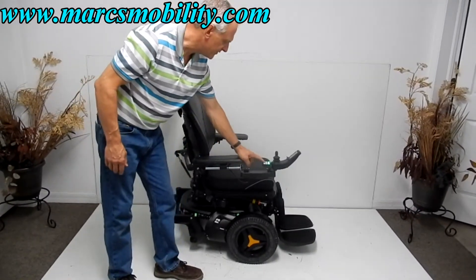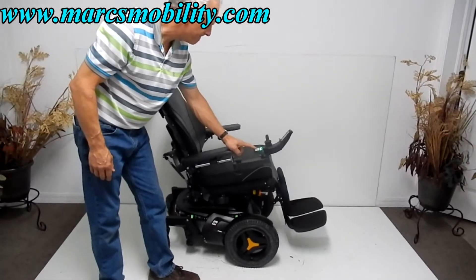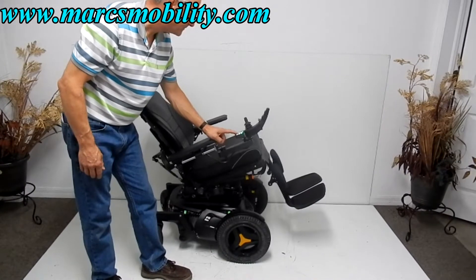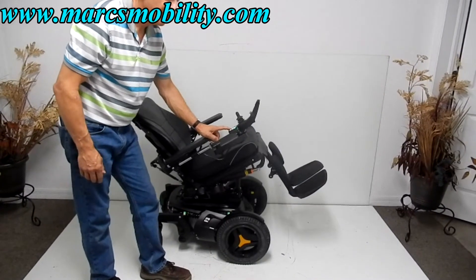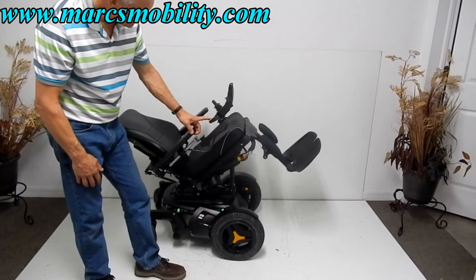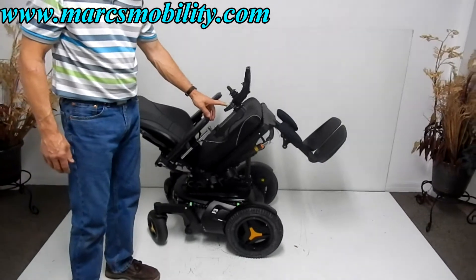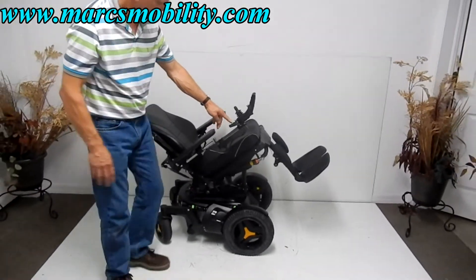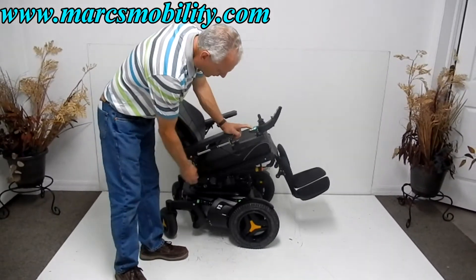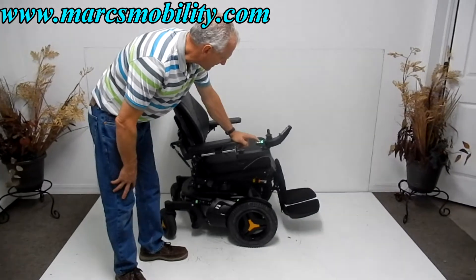The next thing I'm going to show is the electric tilt. You can hardly even hear it — it's so quiet. So this is your full electric tilt right here. I'm going to bring the tilt back down. Nice cushiony arms. You've got a safety belt, which we'll cover in a minute. So now we've got your seat back down.